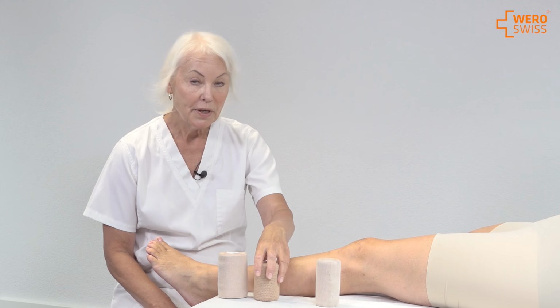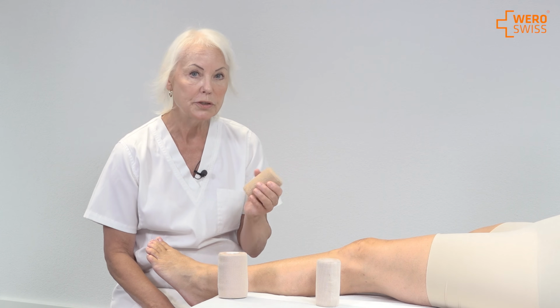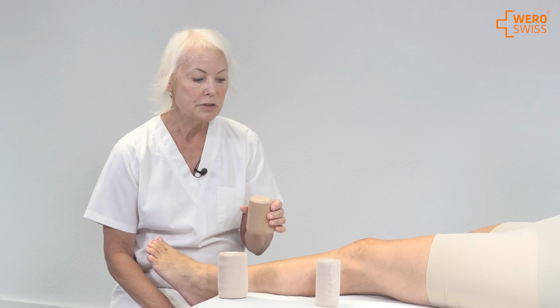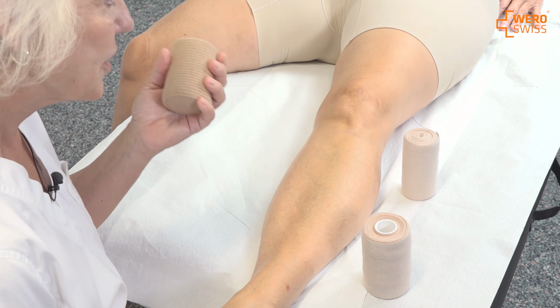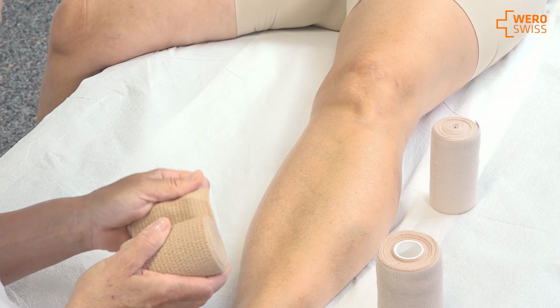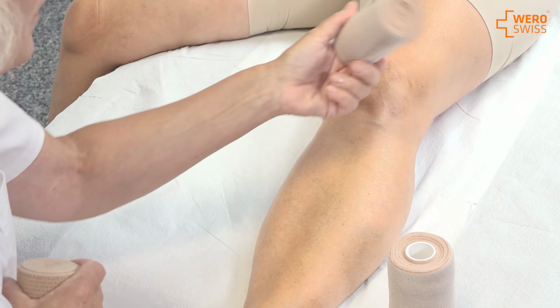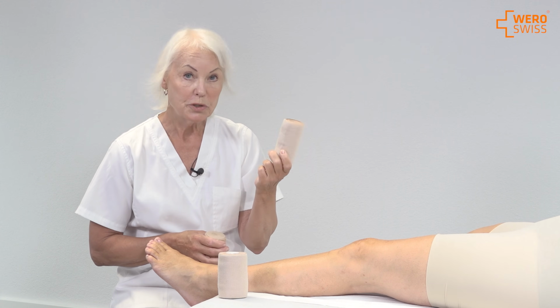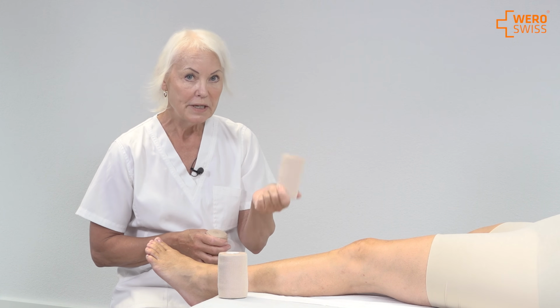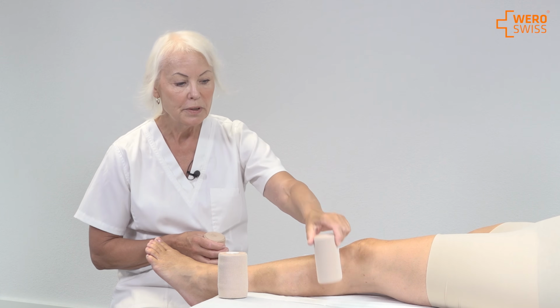The other type that we have, the high elastic bandages, are mostly used for patients that are still. They don't move so much, because the resting pressure here is higher than for the low elastic bandage. The low elastic bandage you can use 24/7. You can bandage the patient, and they can use it during daytime and nighttime.